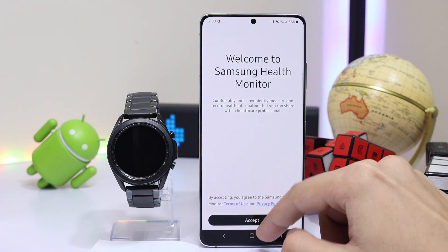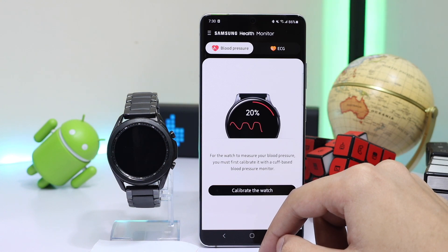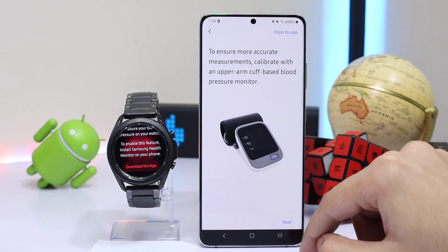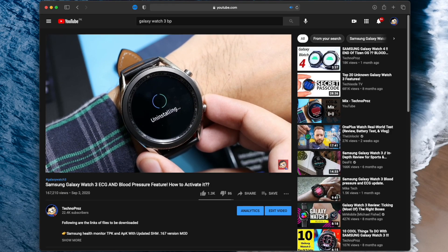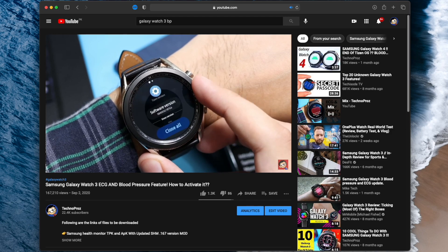Hey, what is up everybody! For today's episode I'm going to show you how you can install ECG and blood pressure application on your Galaxy Watch. The process for the Watch Active 2 is pretty much the same, but I will make a separate video for that soon to avoid any confusion. This is an updated version of the previous video.